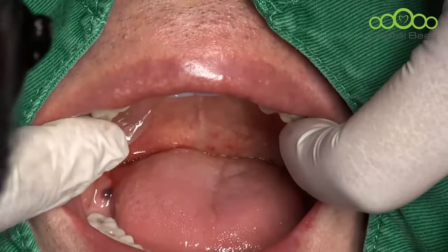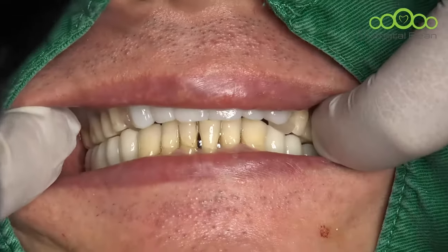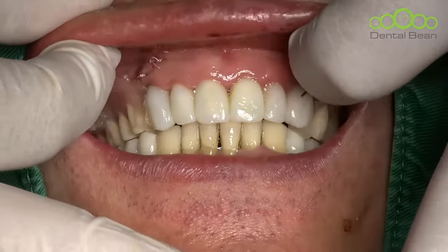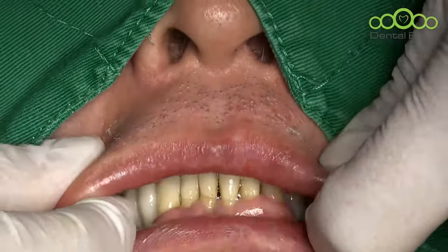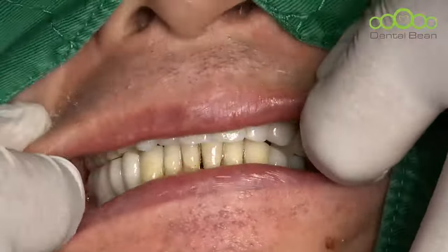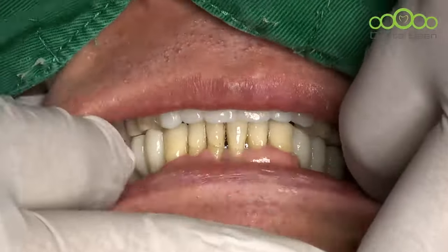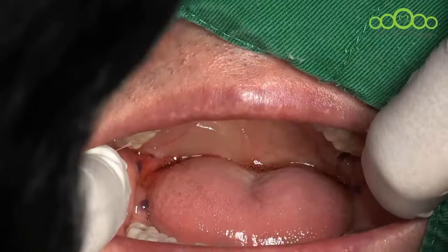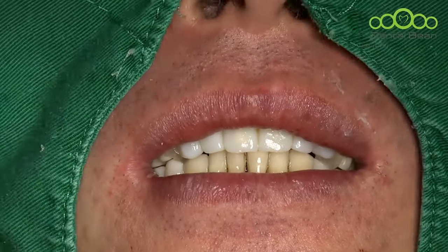Open your mouth. And press down. And bite. And check the occlusion. And then do the border molding. Please move the patient's cheek up and down. And then wait about 2 minutes.